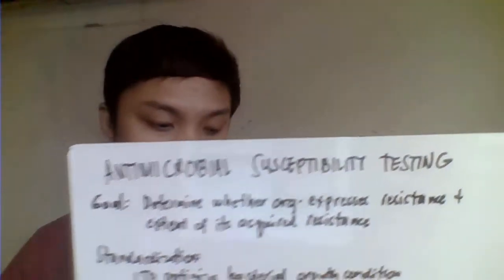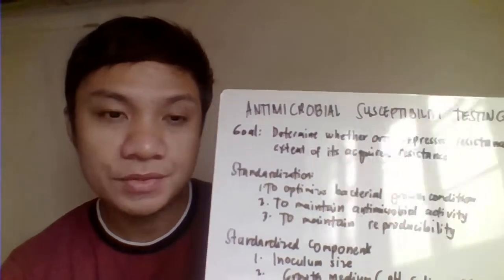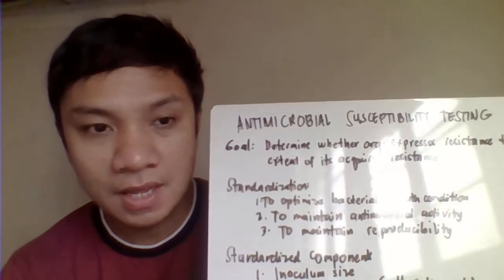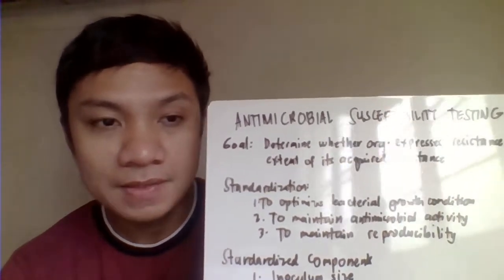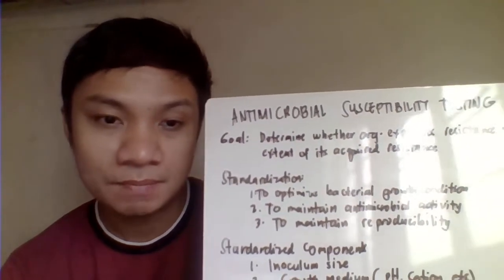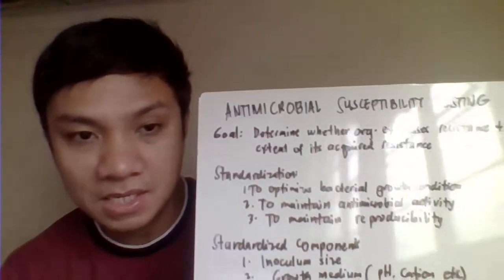Okay, so we discuss the antimicrobial susceptibility testing. This topic will be discussing the method here and how we're able to know if your organism is resistant or susceptible to certain antibiotics. It's needed here for the treatment of the condition of the patient.